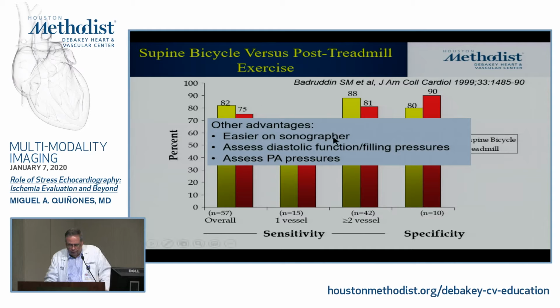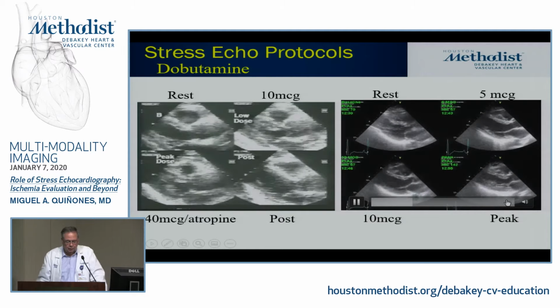Now, the bike has other advantages. As I said earlier, it's easier on the sonographer, and then you have room for other things. You can do a little more diastolic function, PA pressure, valve assessment if you're dealing with mitral stenosis, and so on. So the bike obviously gives you comfort for a lot of other things.